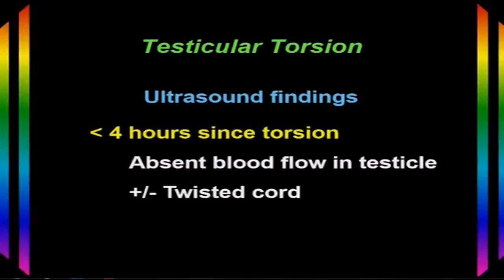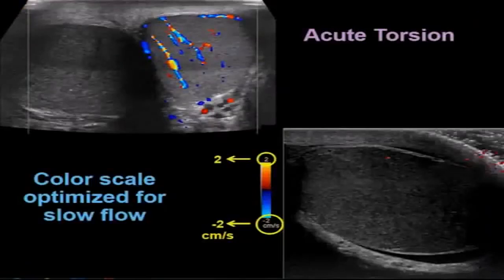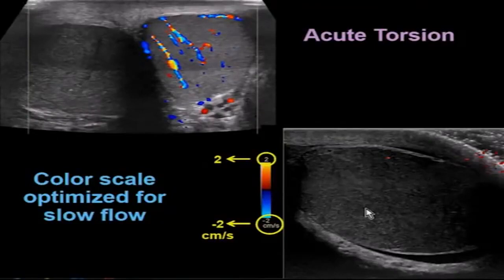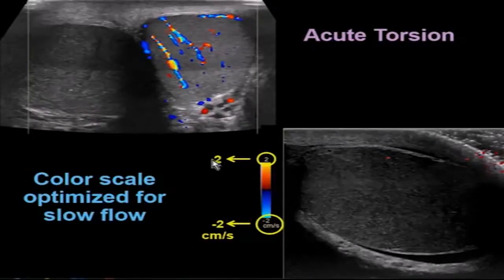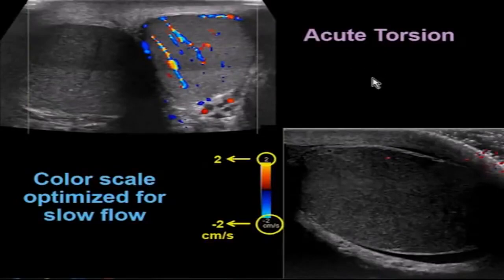With testicular torsion, we'll see absent blood flow in the testicle and may or may not see the twisted cord. Here's a patient with acute testicular torsion — the right testicle is slightly hypoechoic compared to the left, and with color Doppler there's no flow inside it. It's important to optimize the color scale for very slow flow, set here at 2 to minus 2 centimeters per second. Still, we identify no flow in the right testicle, whereas we see good flow in the left.